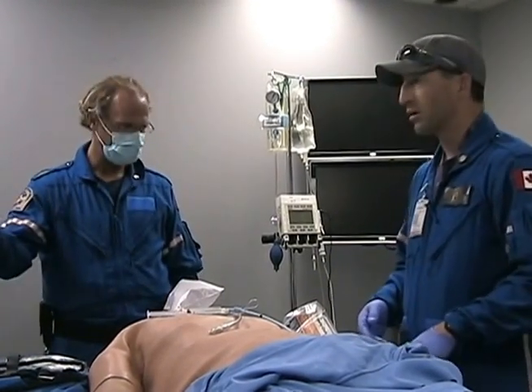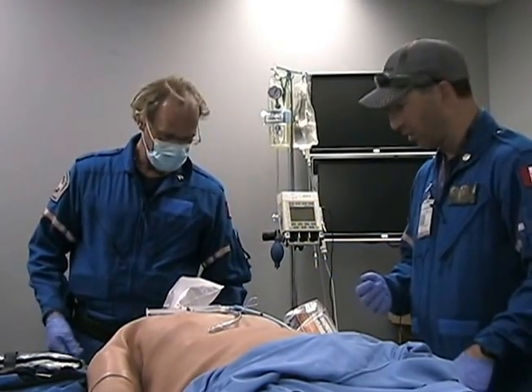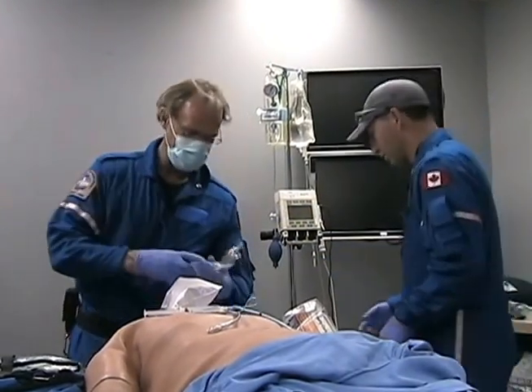That's enough. Did you get the tidal warmed up? Oh, no, I didn't do that. Yeah, I thought you had done that. No, I didn't. I've been a little bit busy here. Oh, okay. Did you mind doing that? Sure. Okay, I think I've got everything else ready to go here.